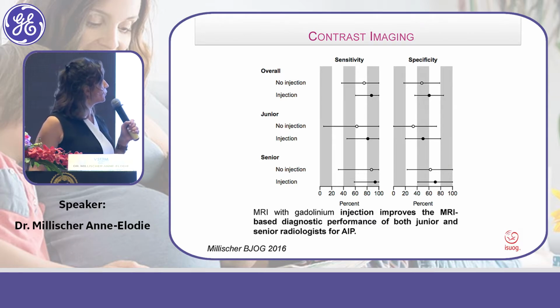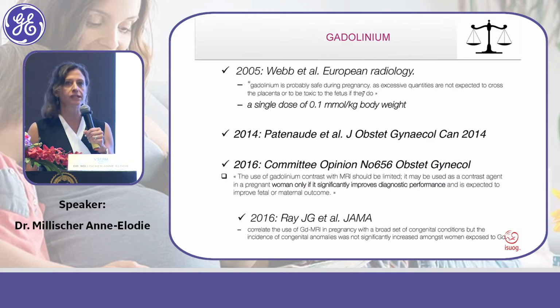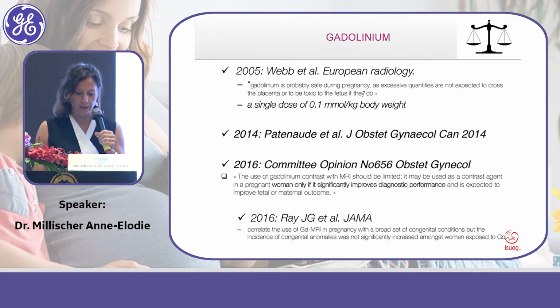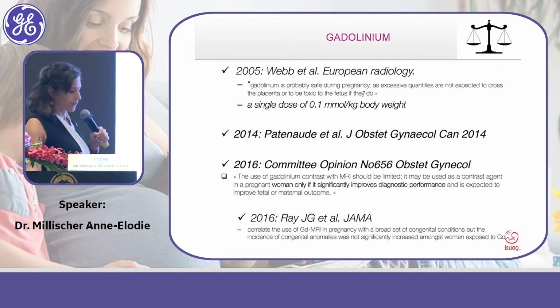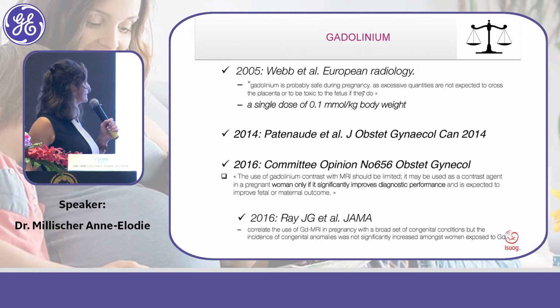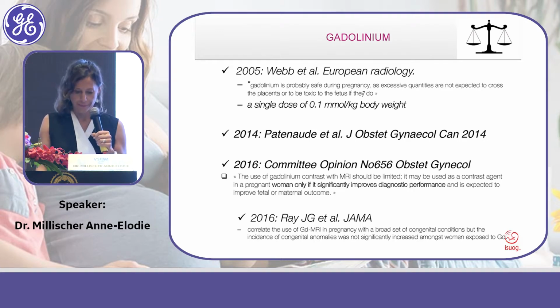And it improves also the capacity for the senior radiologist to diagnose placenta accreta with MRI. Và khi mình khảo sát một cái nghiên cứu trên những cái bác sĩ mới làm về cái bệnh lý này thôi, thì mình thấy là khi mình tiêm thuốc vô thì cái khả năng chẩn đoán chính xác của những cái bác sĩ mới này nó sẽ tăng cao, tương đương với lại những bác sĩ mà đã lâu rồi.